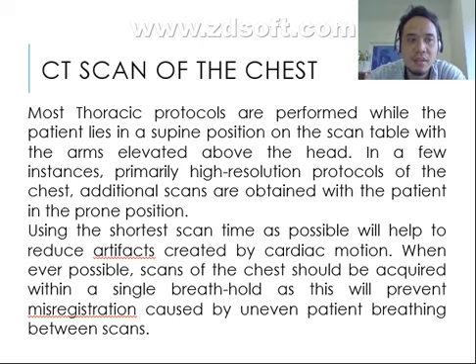So, in order to reduce this so-called motion artifact, we need interventions like shortening the scanning time or instructing the patient to do a single breath hold if he can. As long as he is able.